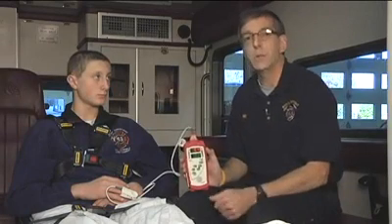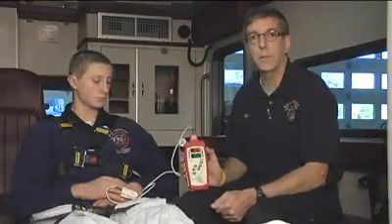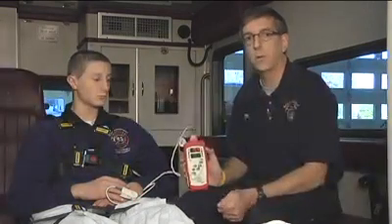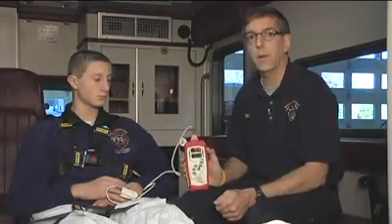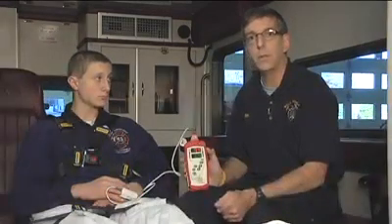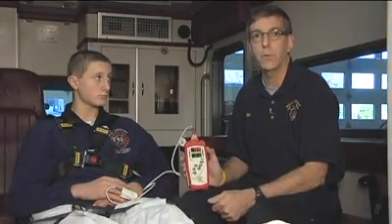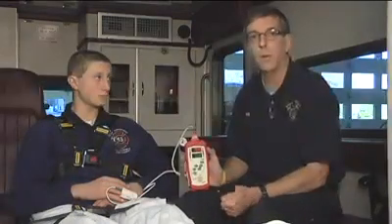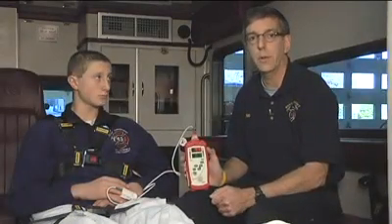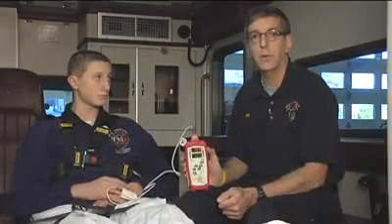Some people question whether sickle cell crisis or sickle cell anemia affects pulse oximetry readings. The answer is no — sickle cell does not affect a pulse oximetry reading. The other question is about darkly pigmented patients, such as African American or Indian patients who have darker skin pigmentation. Pulse oximetry is not affected by darkly pigmented patients.